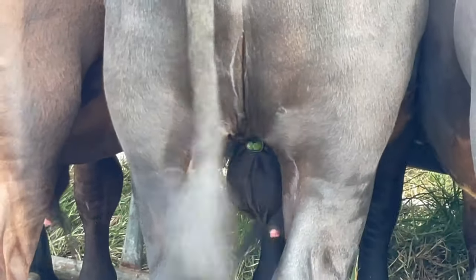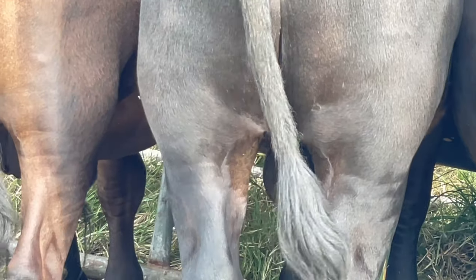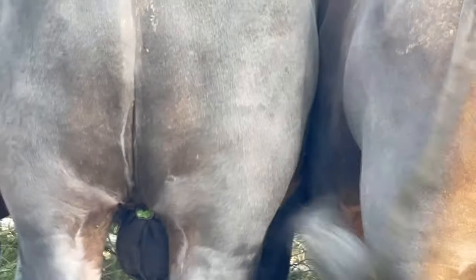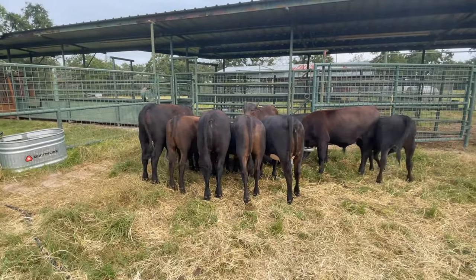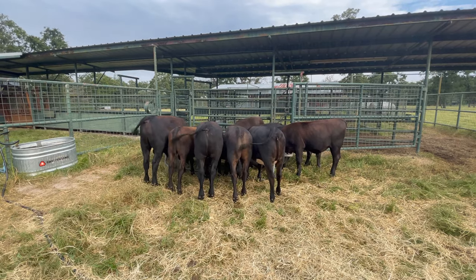I'm very, very pleased with this Calicrate Pro Bander. These calves are doing well, they're happy, not stressed. All is good here.